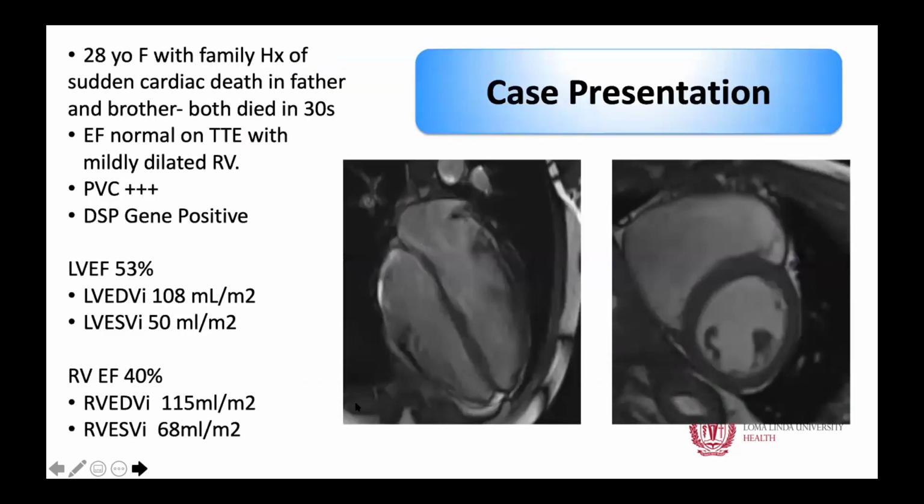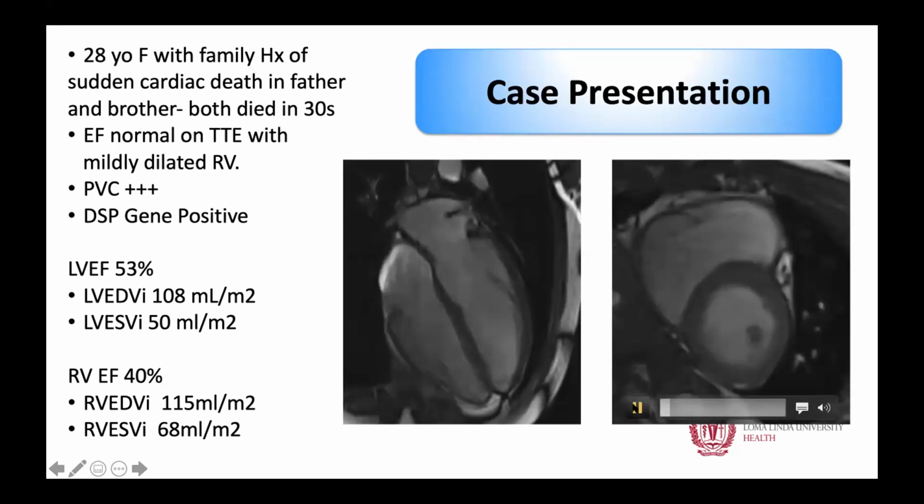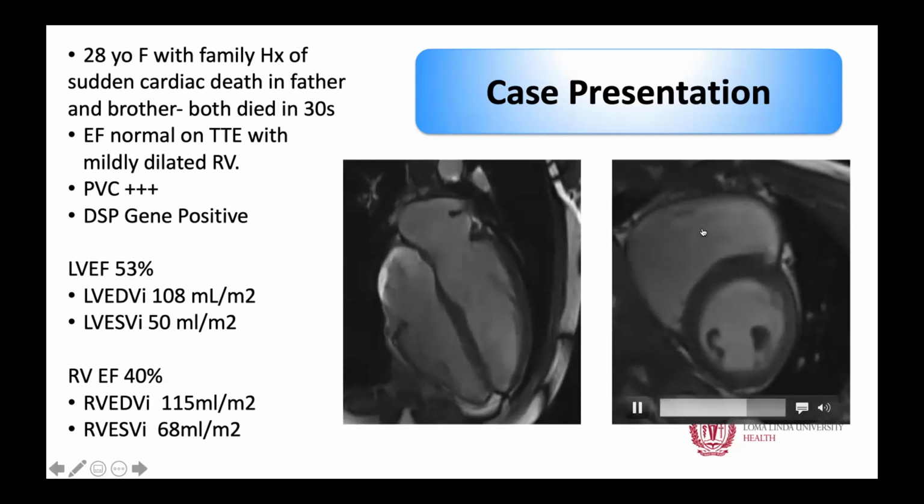So this is really quickly another case that I just wanted to show you. You can see the area of dyskinesis, how it's outpouching. This was quite a young patient. She's actually my clinic patient who is desmoplakin gene positive and has quite a bit of PVCs.